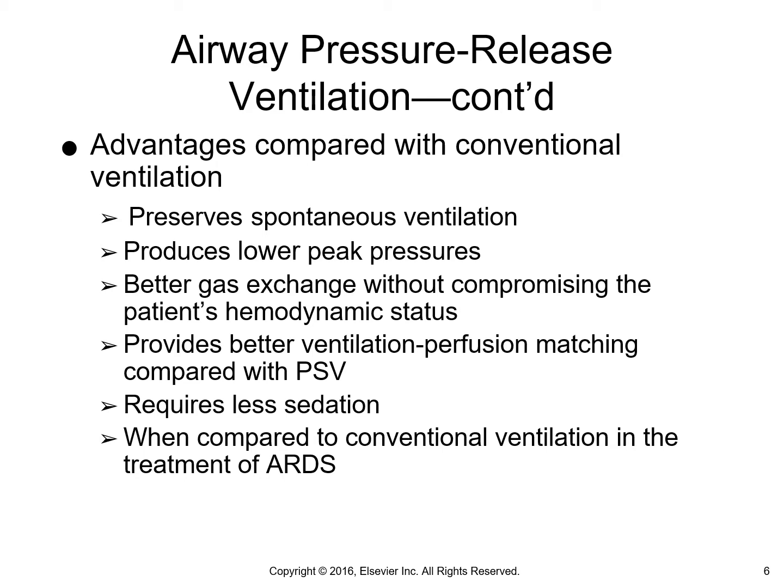It can also provide better ventilation perfusion matching by preferentially providing ventilation to dependent regions that receive the greatest blood flow. It improves gas exchange and lowers PIPs in patients with ARDS compared to patients receiving volume control, and it requires less sedation.